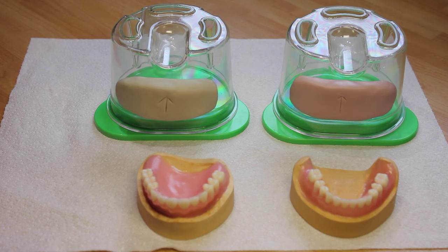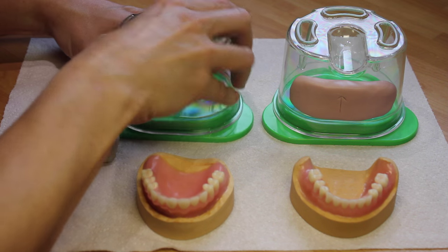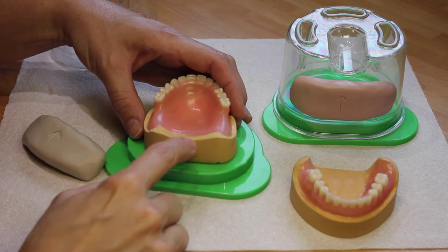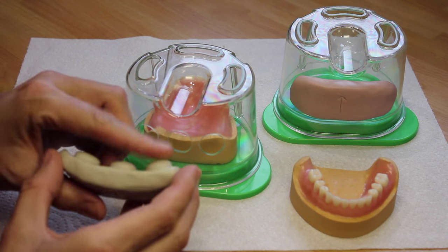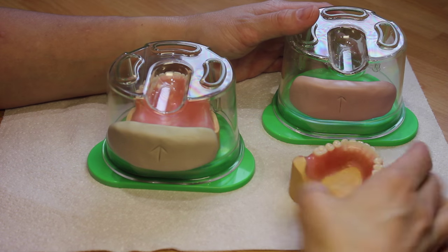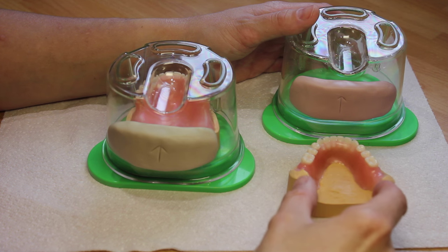The next stage is to add three wax channels onto the posterior section of the denture to allow the acrylic to pour in and allow air to escape. We're using customized flasks, so I will plan for the wax sprues to emerge from the rear of the model, lining up with the three holes, and they will need to butt up against these bungs. The lower will be exactly the same but the centre sprue will come from the lingual floor and two short sprues from the heels.